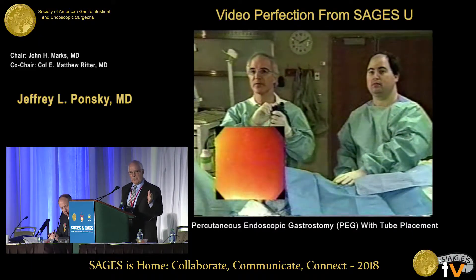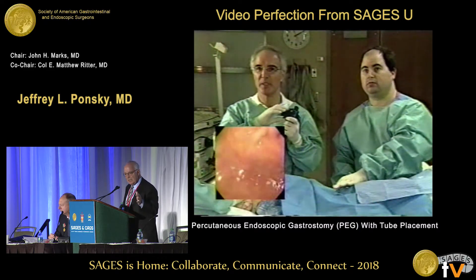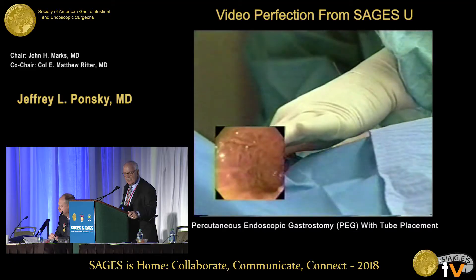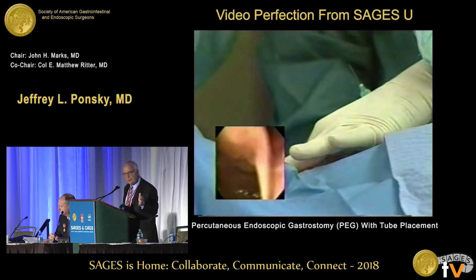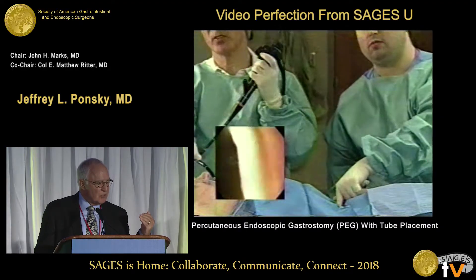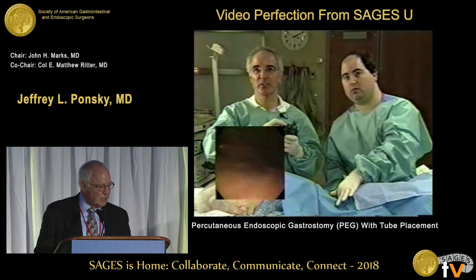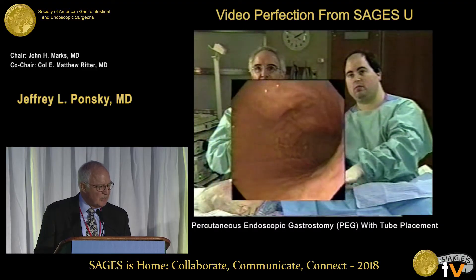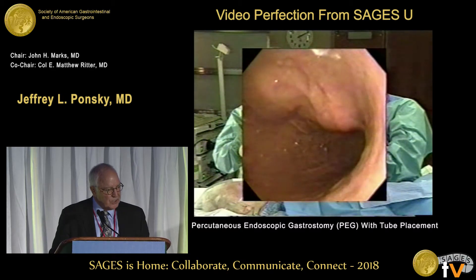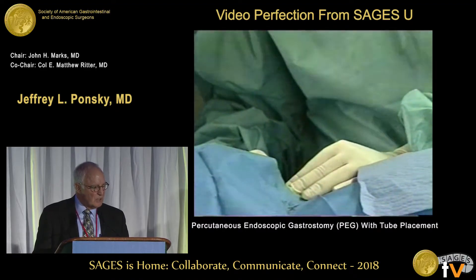Now the most important part of the case is to find the right site. Transillumination was what we used to write about, but I like this finger pressure technique. My assistant is pushing, and we don't see any clear indentation right away. You come a little bit more proximal. I like to tell the assistant: go up sub-xiphoid, start immediately sub-xiphoid, and work your way down the left costal margin if you don't see indentation. Then suddenly you'll start to see indentation. You can make that indentation better, keep working there. Now you start to see a direct, easy indentation, and at that point we put in a little local.